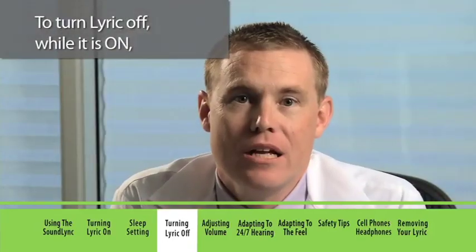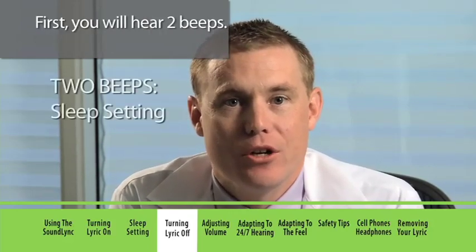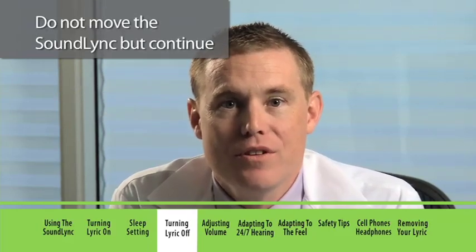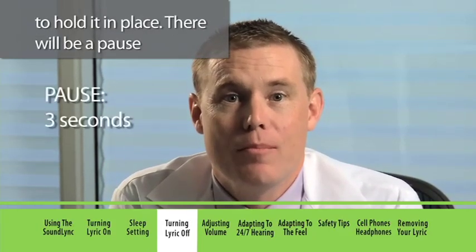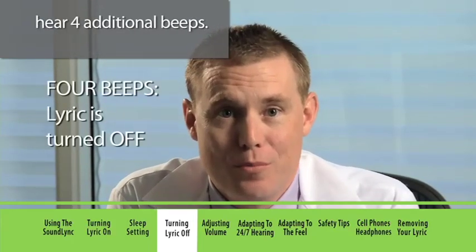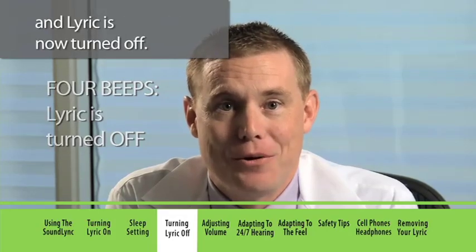To turn Lyric off while it's on, hold the SoundLink in position. First, you'll hear two beeps — this puts Lyric to sleep. Do not move the SoundLink, but continue to hold it in place. There will be a pause of about three seconds and then you'll hear four additional beeps. Remove the SoundLink from your ear and Lyric is now turned off.